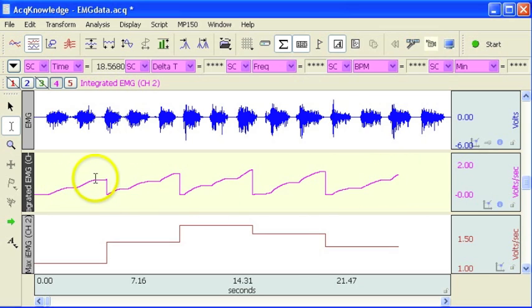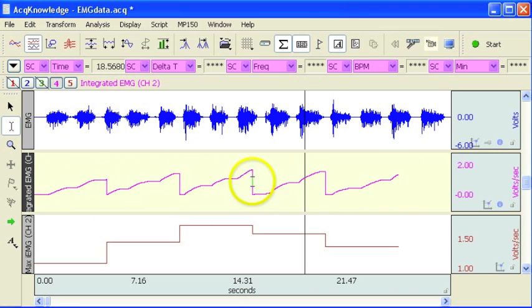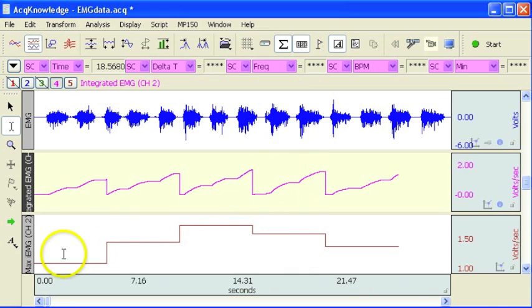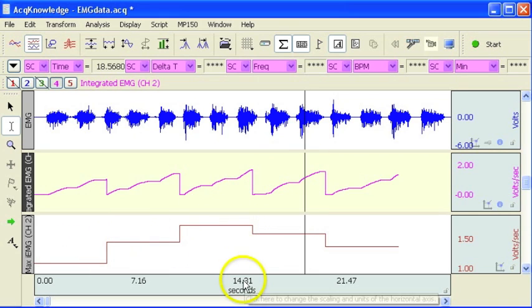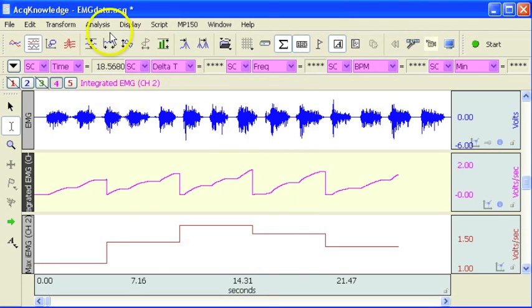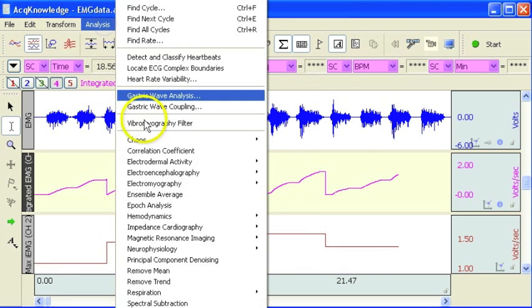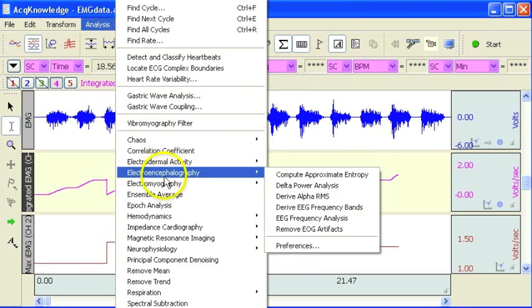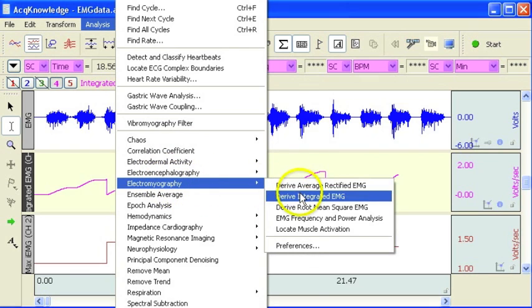So really we've only got enough data to look at 1, 2, 3, 4 complete bins. That concludes our demonstration of the electromyography derived integrated EMG routine.